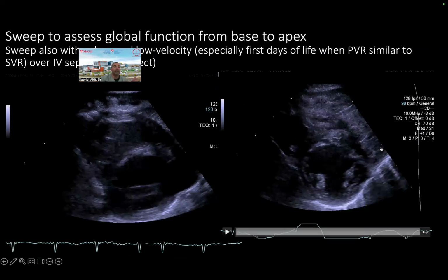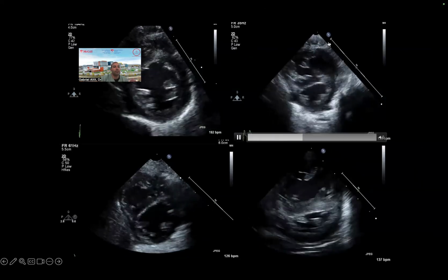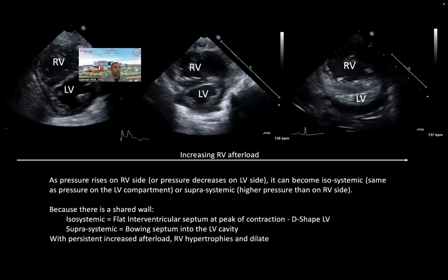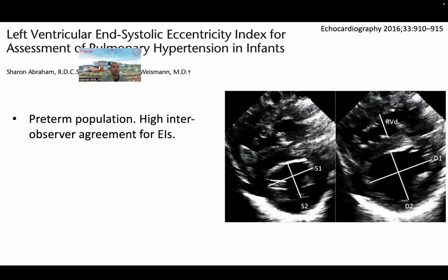That's the focus, basically, at the level of what you want to see. So you can change your focus to adjust it on the structure of interest. Some machines don't have focus. For example, the GE Vivid E95 doesn't have a focus. It will autofocus automatically on the image.